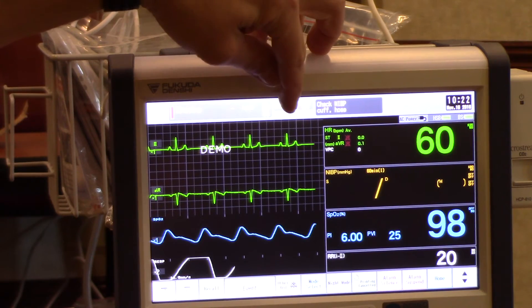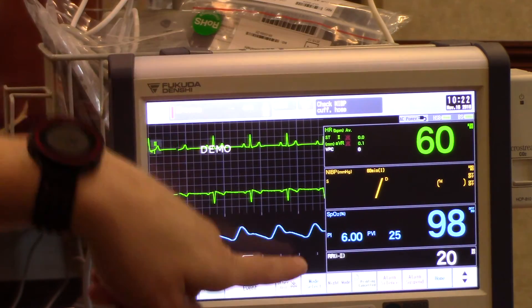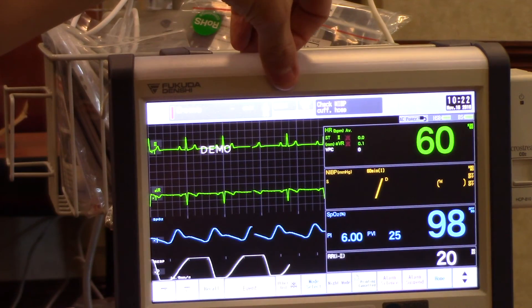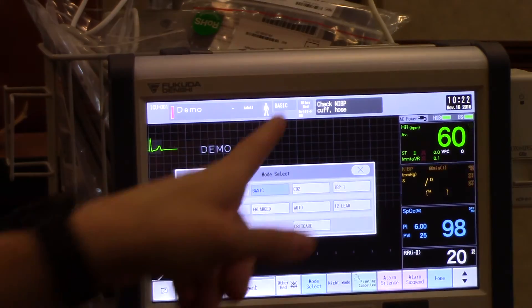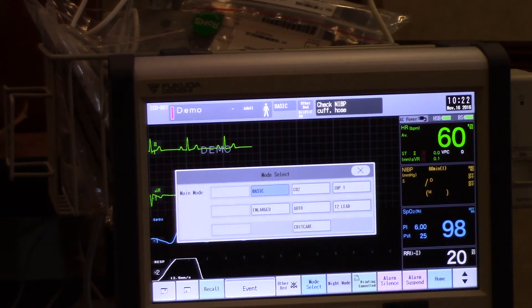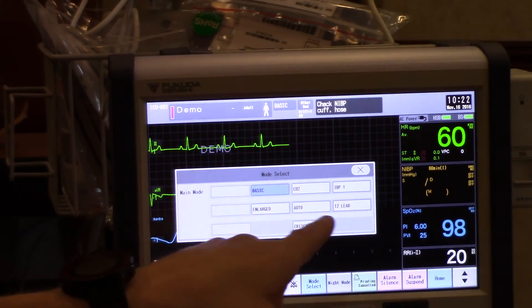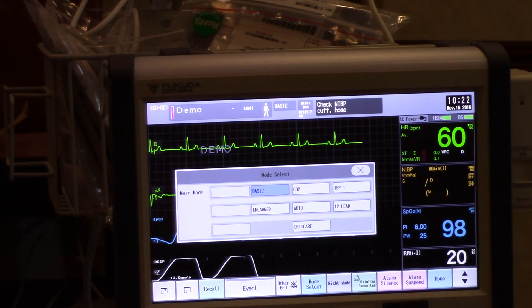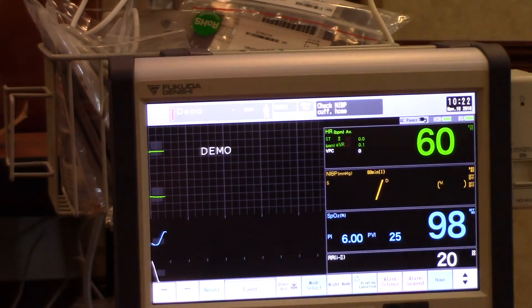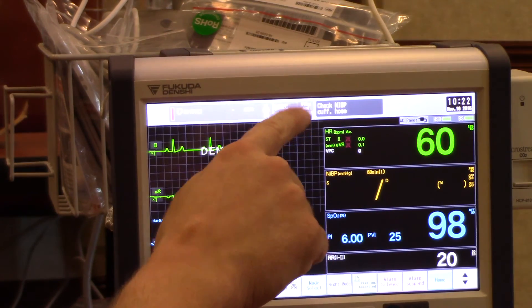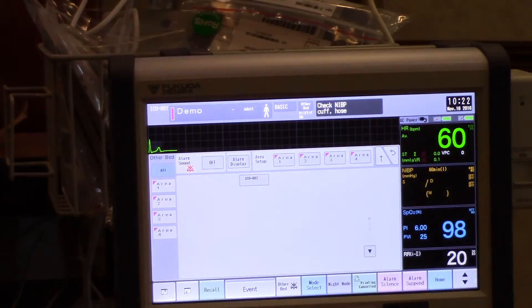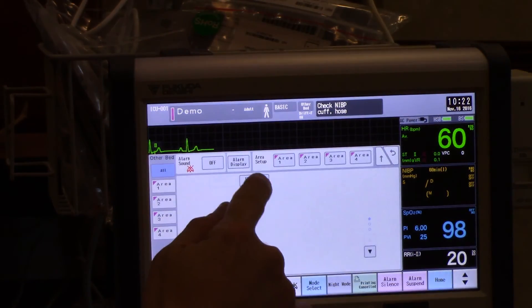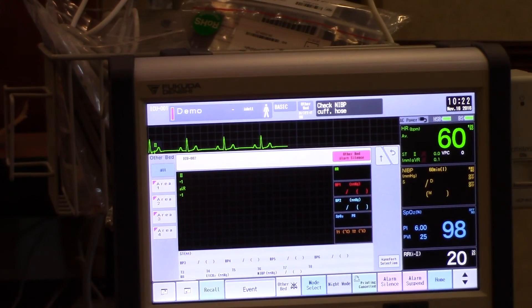The mode select key that I have in the user keys at the bottom is mirrored at the top by simply pressing where it says basic. Now I can select which view I'd like to monitor. Next to basic it says other bed, which also allows me to bring up my other bed function and monitor another patient room.